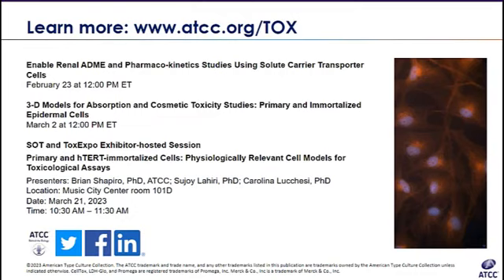This next question is about passaging. How long can the RPTEC SLC transporter cells be passaged? Well, I do know we verified that it could be done for at least 10 passages. Granted, since these cells are immortalized, in theory they can be passaged indefinitely. Okay, but tested at ATCC for up to 10 passages then? Yes.